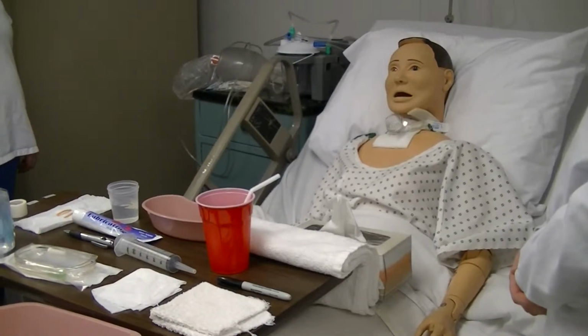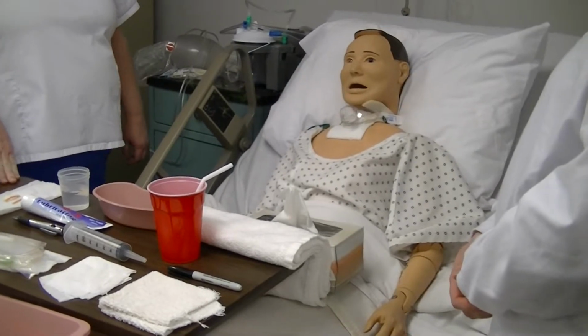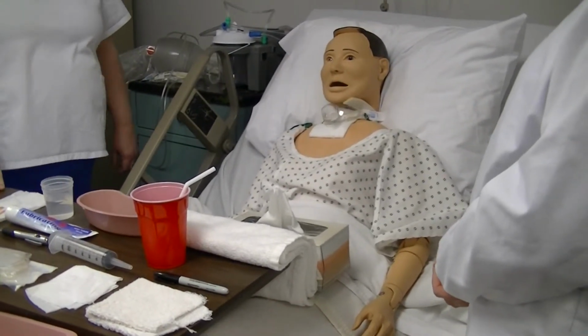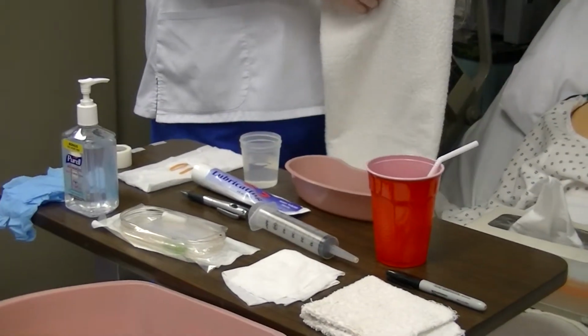Okay, today we are going to demonstrate the insertion of a nasogastric tube. First thing we are going to do is prepare our equipment at bedside, which we have pre-done.